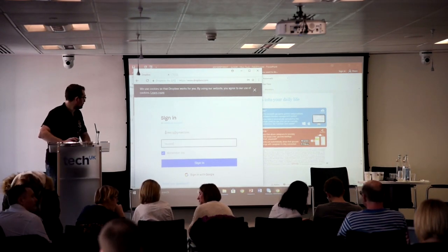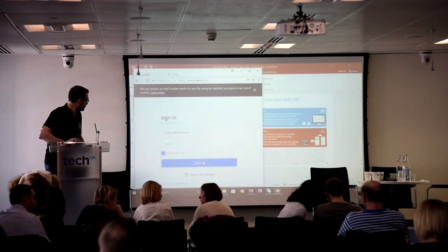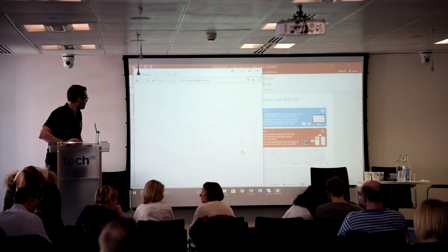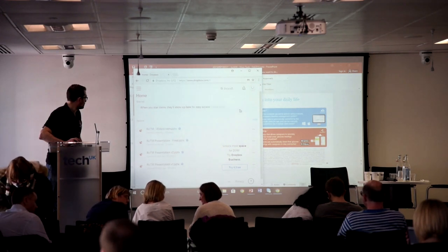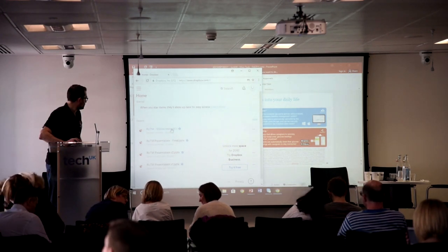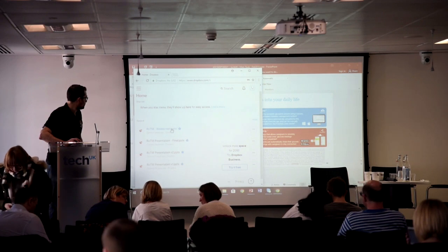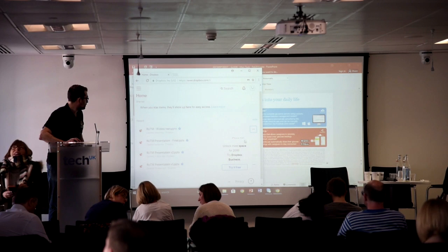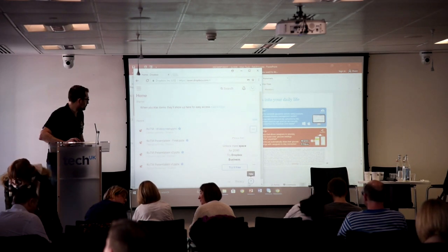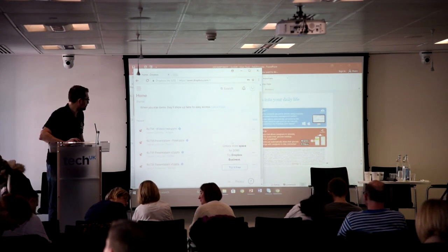I will warn you, people who are technical tend to have a harder time than non-technical people, because you get so wrapped up in looking under the hood and saying this should be different, let me fix it now. So what I would say to you is you're already complexifying it by putting it in a different setup, like you're not running it on a rig. So I would focus on just setting it up and observing it, even if you don't let it change things yet. Use that, and then go back under the hood and fix all the things.